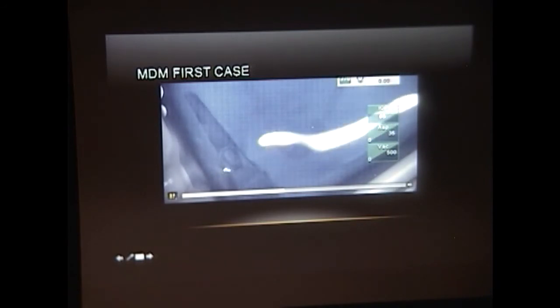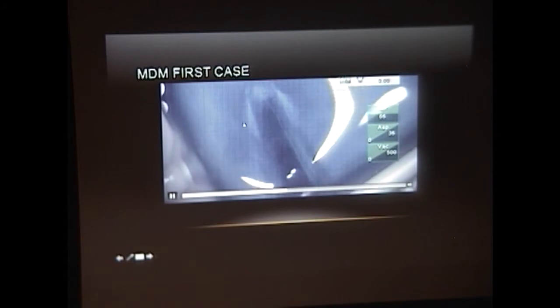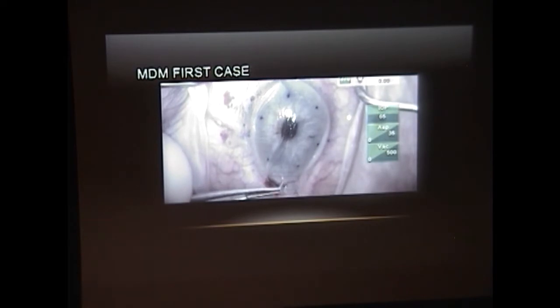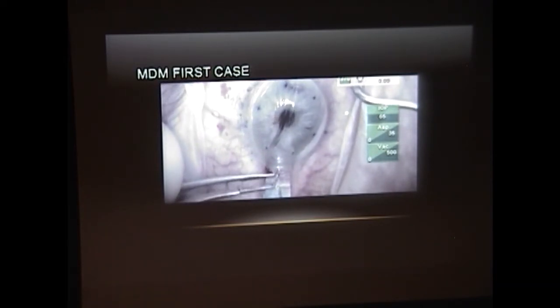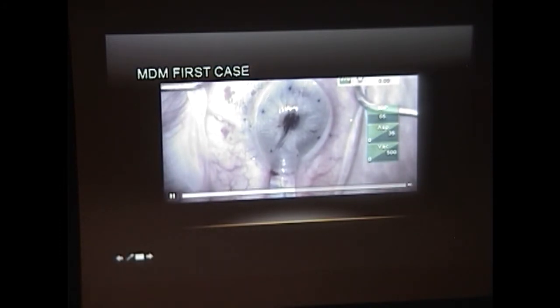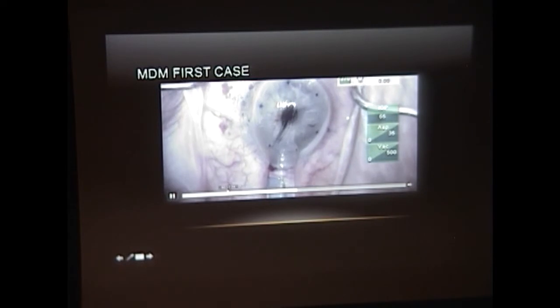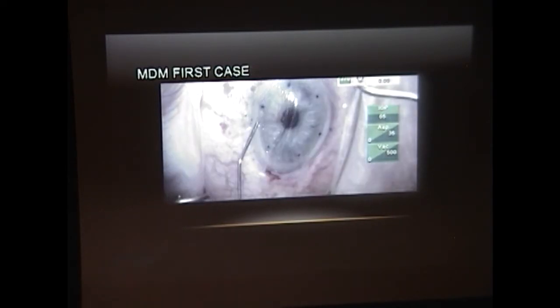And so we thought the hard part was going to be unrolling it in the eye, but we found that just getting it in the eye was really the most challenging part of this particular case, as you'll see. So we're softening the eye, letting some fluid out, nice soft eye. We don't want to inject it and then have it squirt right back out our wound. And here we are injecting. You'll see fluid going in a minute. And the graft isn't moving.